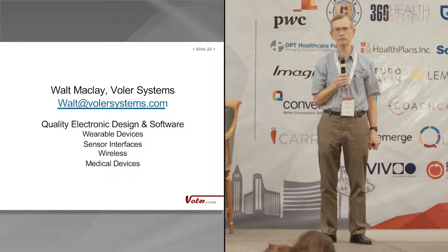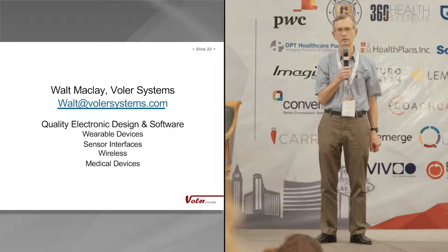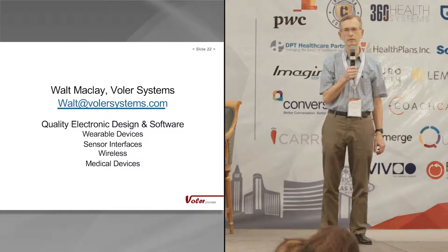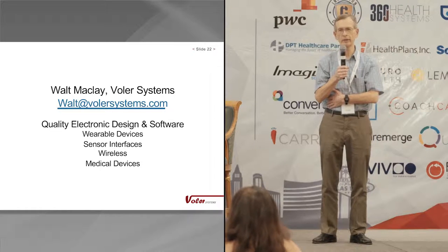I have a question really about the glucose monitor. Is that truly a mobile device, or what? Because I know that there's a couple devices out there that claim they can track glucose, and really what it is, is trending. So I'm not familiar, except maybe Dexcom, maybe? Yeah, Dexcom is one. There's several companies that have patches. They're worn on the abdomen.